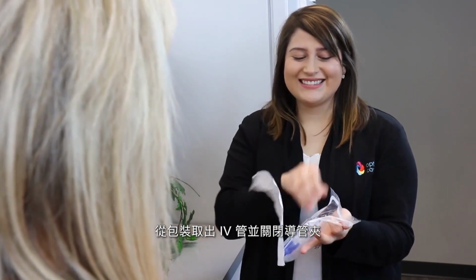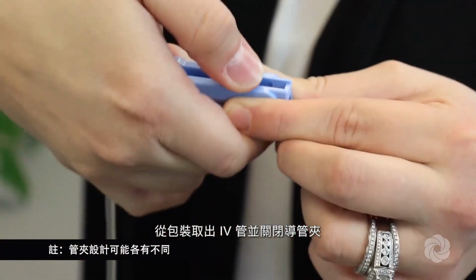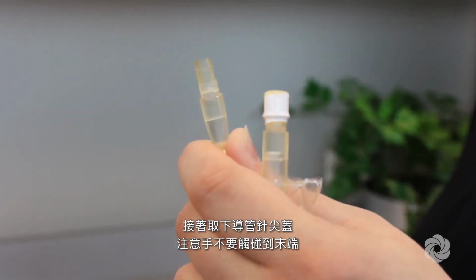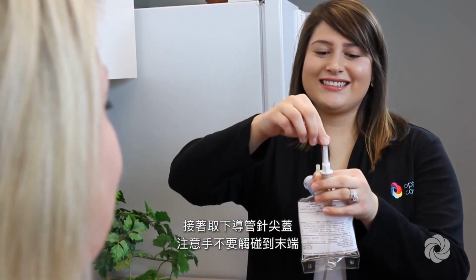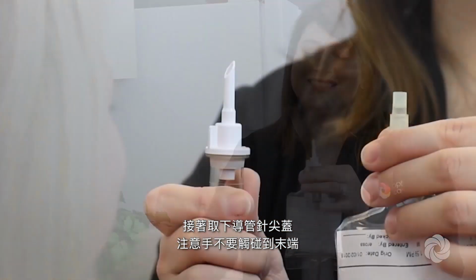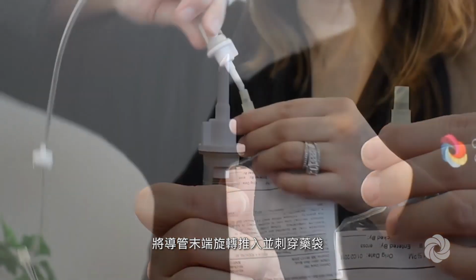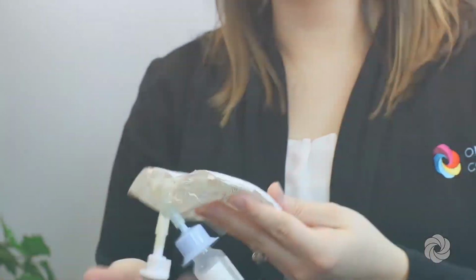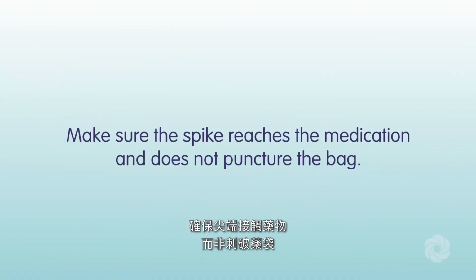Remove the IV tubing from its package and close the clamp on the tubing. Remove the tab from the medication bag. Then, remove the cover from the spike of the tubing, being careful not to touch the end. Spike the bag by pushing and twisting the end of the tubing into the bag. Make sure the spike reaches the medication and does not puncture the bag.